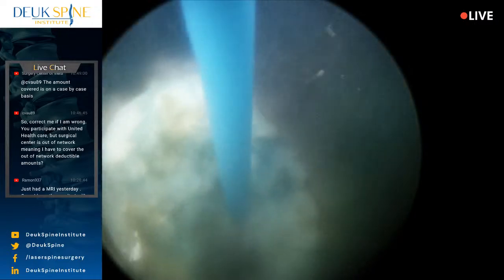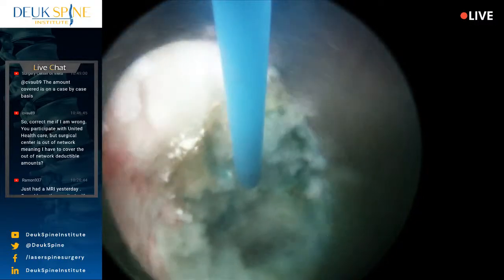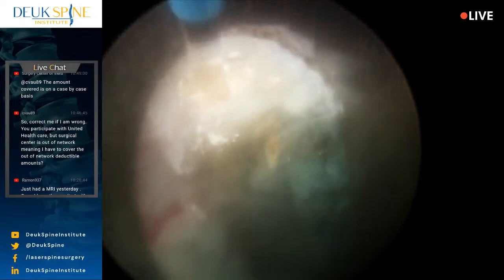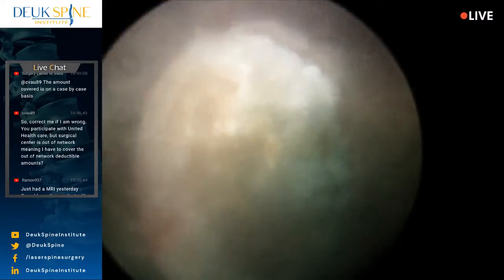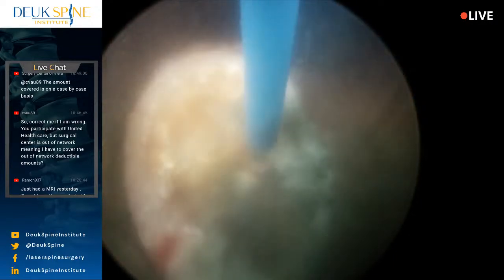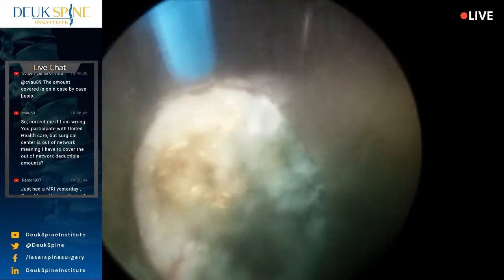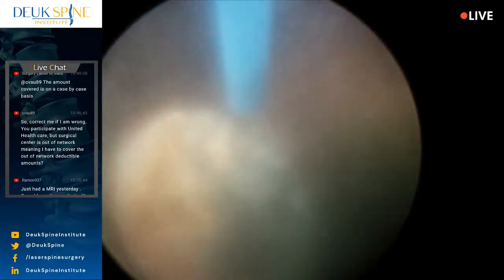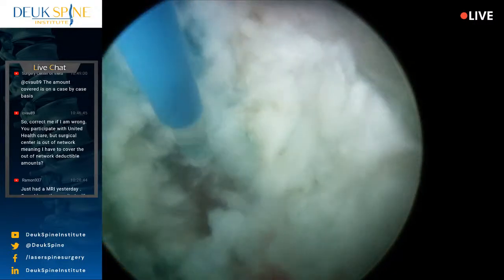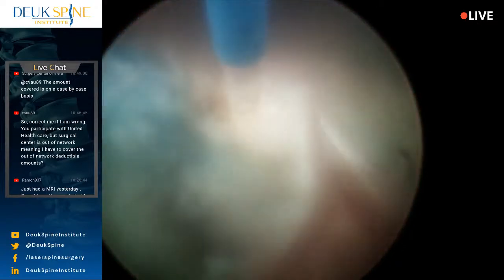All of this is scar tissue, and it almost looks like this patient had an epidural injection. It's quite likely. This is all scar tissue from the inflammation. This is not normal, shouldn't be here. This is all related to the annular tear. And this part of the herniation looks like it's been around for a while. I would say years, at least 4 or 5 years. I don't know the exact age, but this part here is definitely fresher, newer.